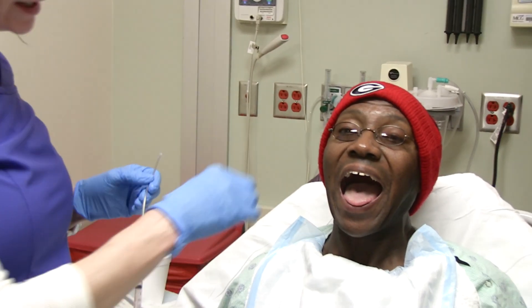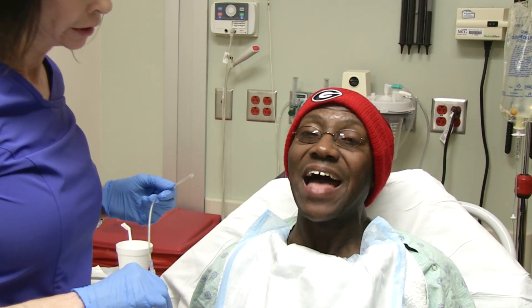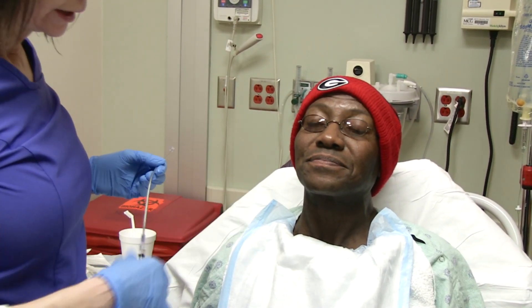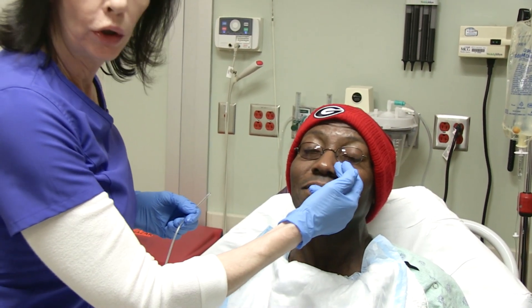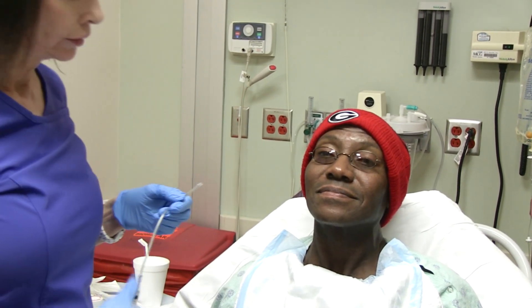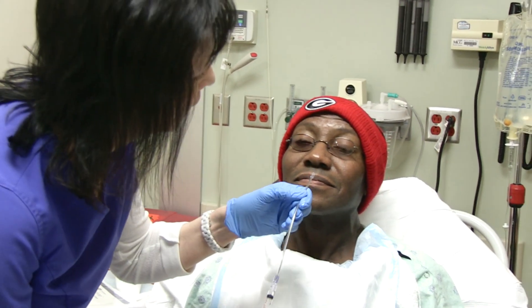So we check for any nasal deviation. He is a very experienced person as far as having NG tubes placed. I'm going to spray your nose next. He has a stricture over here, so we're going to go on this side. Always ask the person if their nose has ever been broken or has a septal deviation or anything like that.